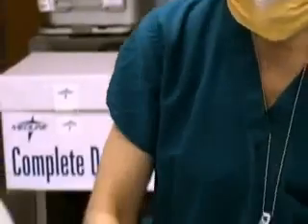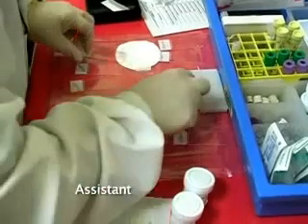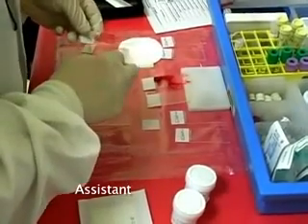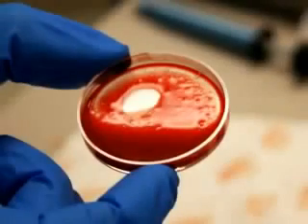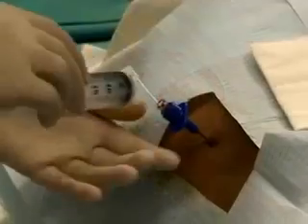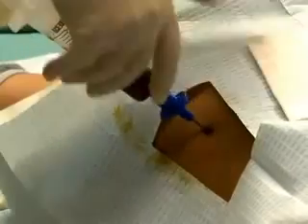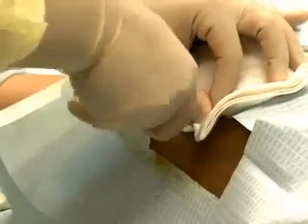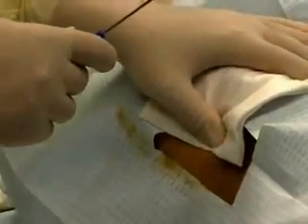Note that you may hand a syringe to an assistant or pathologist, taking care to maintain sterility. The non-heparinized aspirate should be used to prepare specimen slides. Adequacy of the specimen can be verified by the presence of bony spicules in the sample. Next, aspirate marrow into syringes containing 1 milliliter heparin as needed for diagnostic tests. Remove the aspiration needle and apply pressure with sterile gauze until you are ready to perform the biopsy.